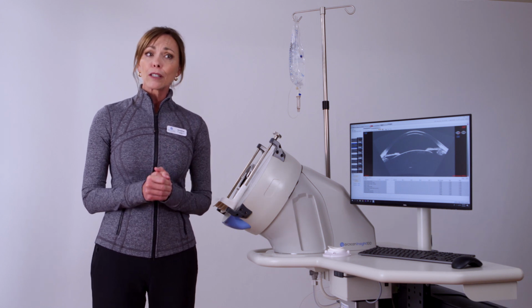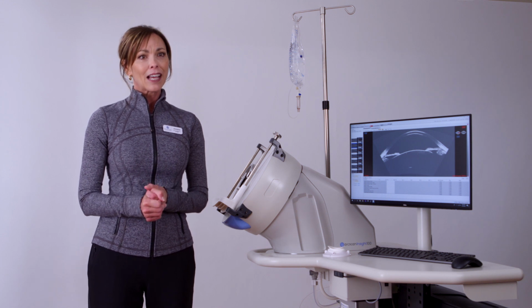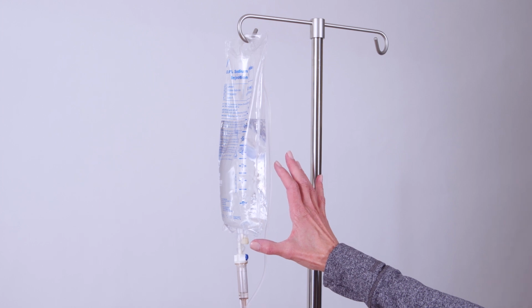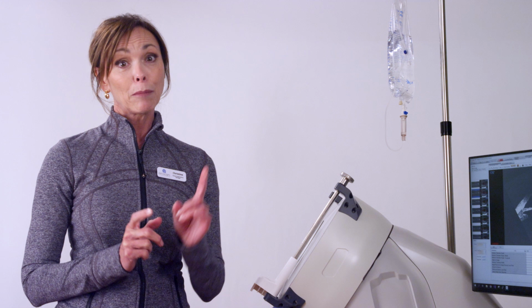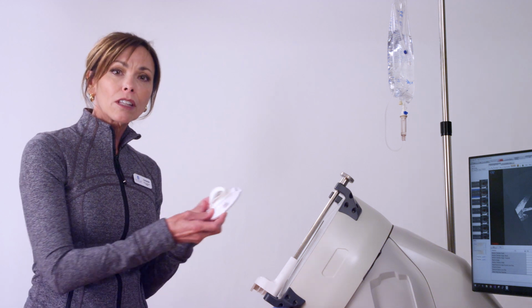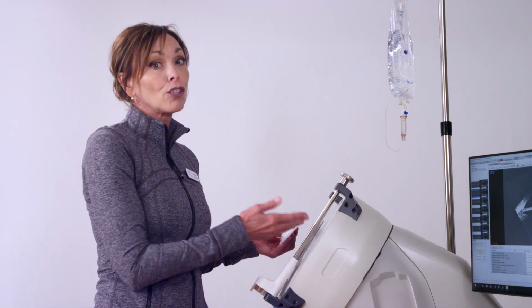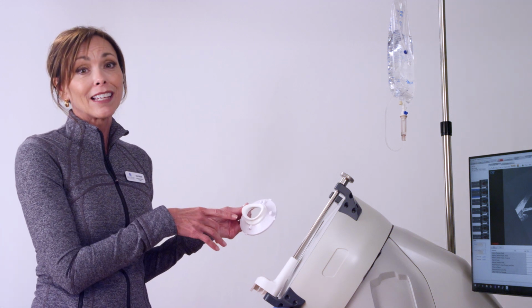The second fluid, which completes the full fluid pathway required for ultrasound, is balanced salt solution, also known as BSS, or saline. This does have contact with the patient's eye by way of this, one per patient disposable EyeSeal. The EyeSeal attaches to the device here, and once attached, and after the patient is positioned against the EyeSeal, this small cup will fill with the saline.